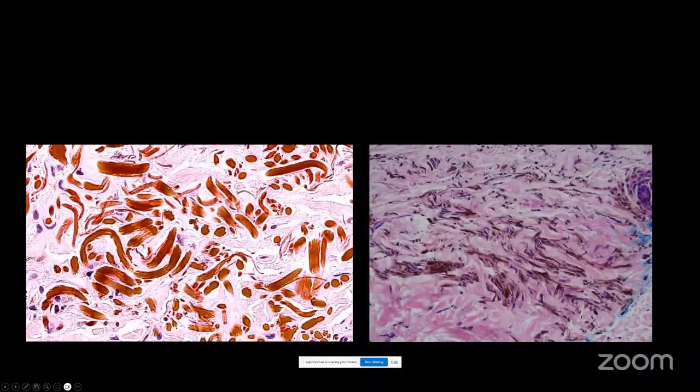It's very distinct. Sometimes it can look a little bit like blue nevus. Of course, this is the really crazy version of it. Almost looks like art, doesn't it? Anyway, blue nevus though can sometimes have some overlap if you have it early, like here.